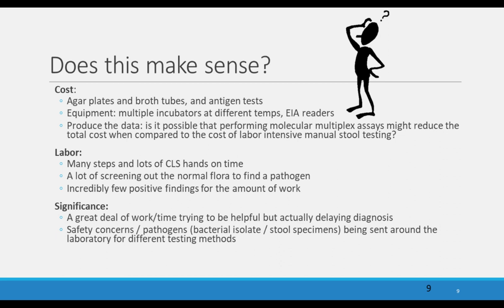we're delaying diagnosis. Sometimes we don't have significant results until 72 hours or longer down our pathway. There's also safety concerns. If we're dealing with pathogens out in our laboratory on the bench, we could have many bacterial isolates being sent around the laboratory for different testing methods, and this is a potential safety concern.